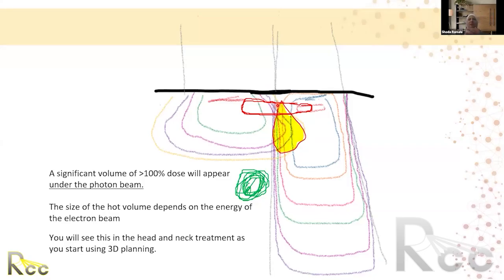If these were uninvolved lymph nodes, meaning they're going to go to 50 gray or maybe 55 gray at best, this is just a recommendation, maybe you could afford to underdose them, like 90% of them get prescription dose, or 95% get prescription dose. But if those were involved nodes and your intention is to take them all the way up to 60 or 66 gray, then underdosing them would compromise treatment.